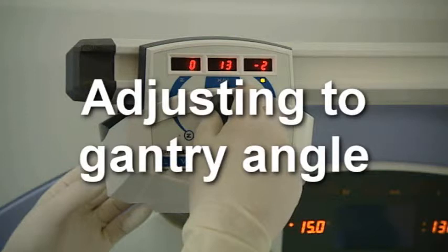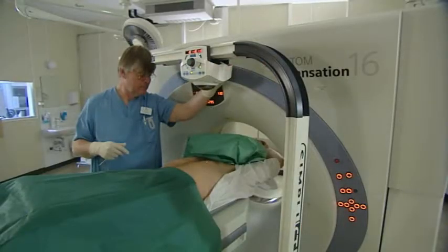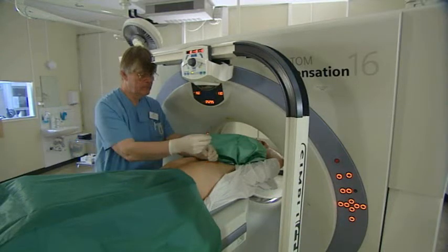If angulation is required in two planes, enter the appropriate cranio-caudal angulation in addition to the angulation in the axial plane. Then align the needle with the laser dot at the hub of the needle.